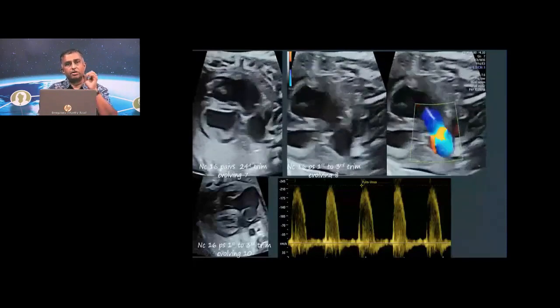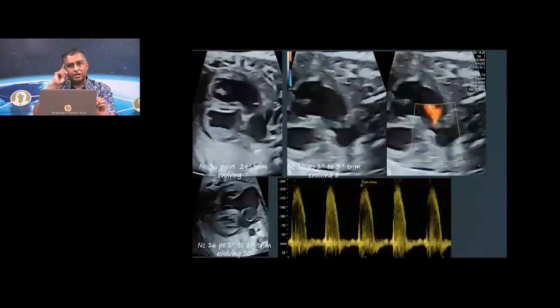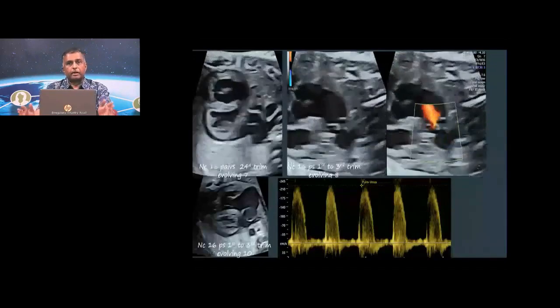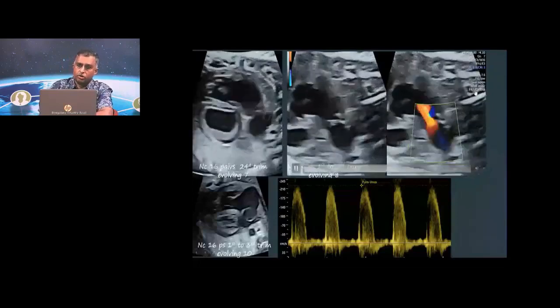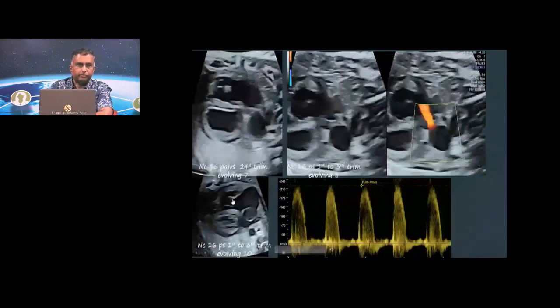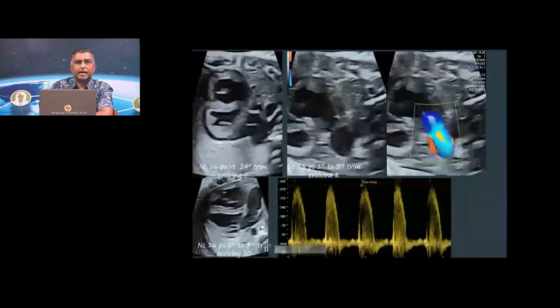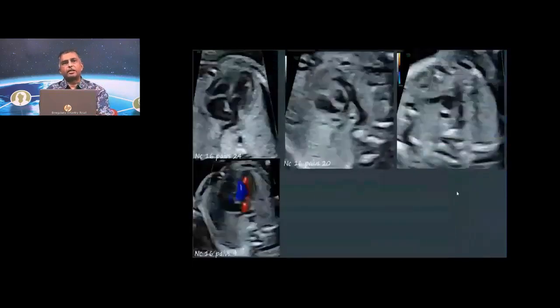And therefore, when there's a stenotic pathology, you will find that the aliasing which occurs draws your attention and tells you that there's a hemodynamic disturbance over here in terms of a stenosis. Also, you can recognize that there's a pulmonary regurgitation happening there, and that's the 4-chamber view, cardiomegaly, which you see over there, and that's the systolic jetting which you have. So all telling you that you're dealing with a critical pulmonary stenosis.